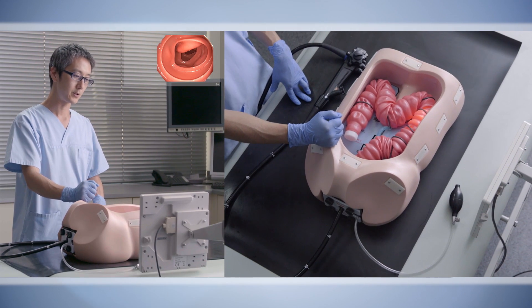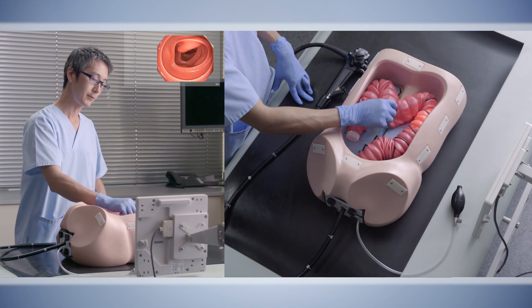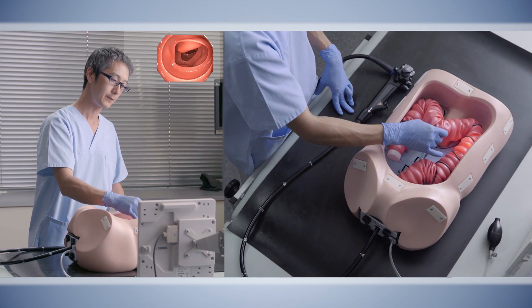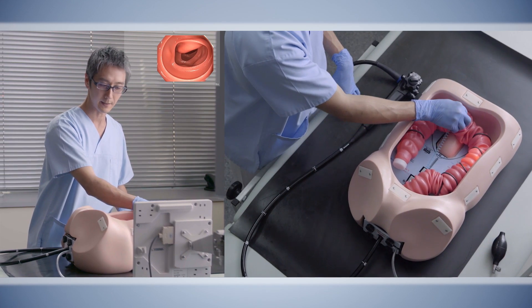We will now go to Stage 2 of colonoscopy, which involves trying to straighten out the mobile portion of the transverse colon. Our goal is to have the transverse colon shortened so that it would end up looking like this.